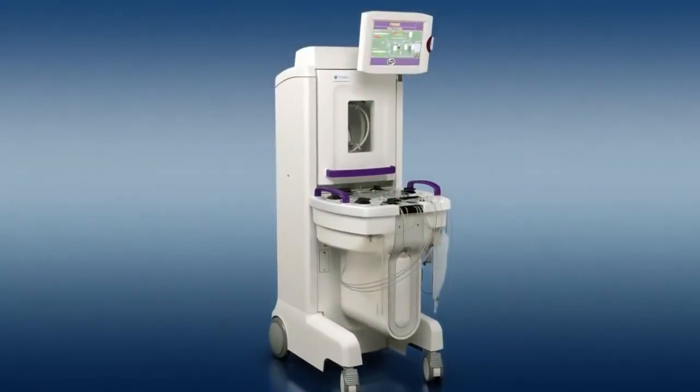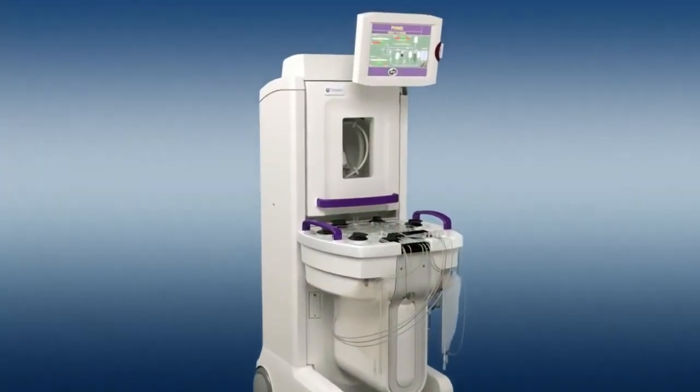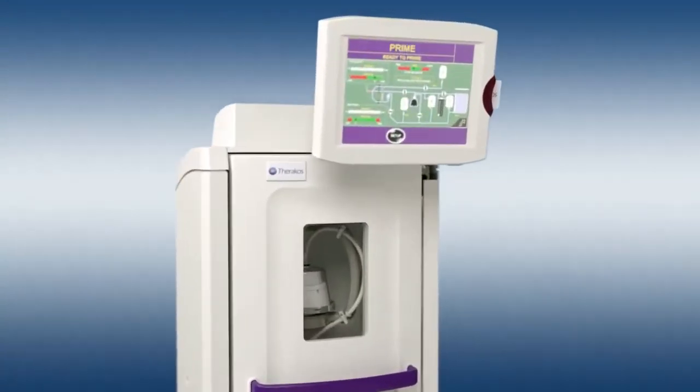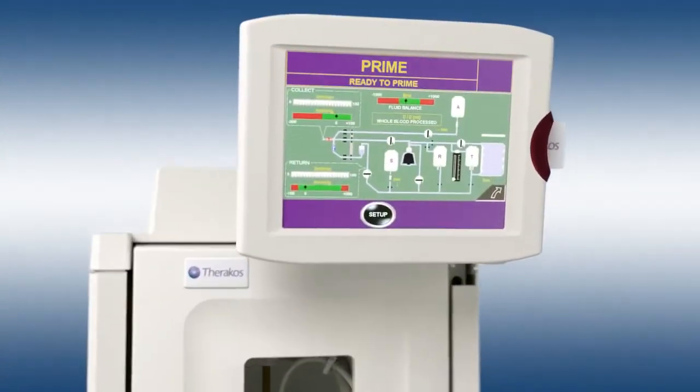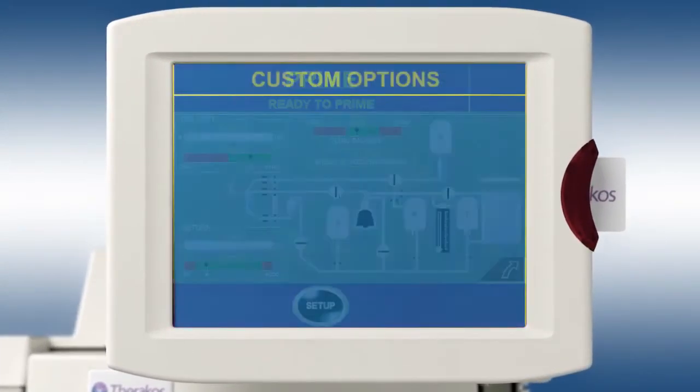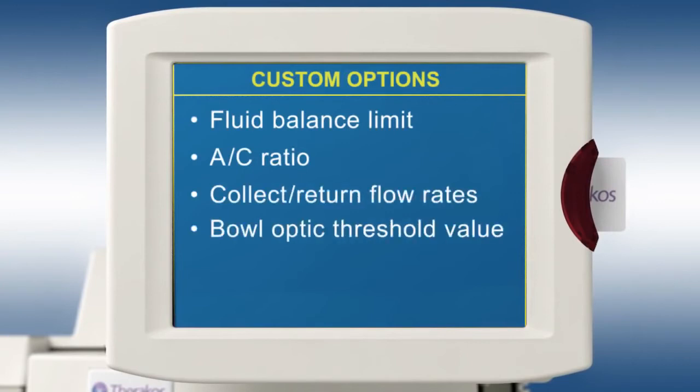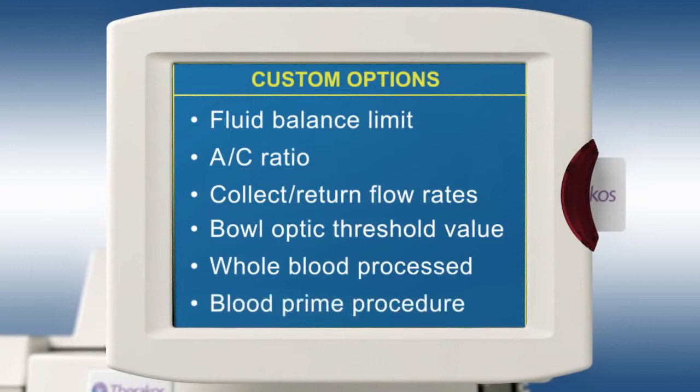The Theracose Celex photophoresis system allows physicians to customize their treatment options using the sophisticated user-friendly operator interface. Some options available to the healthcare professional within the interface are fluid balance limit, AC ratio, collect return flow rates, bowl optic threshold value, whole blood processed, and the ability to complete a blood prime procedure.